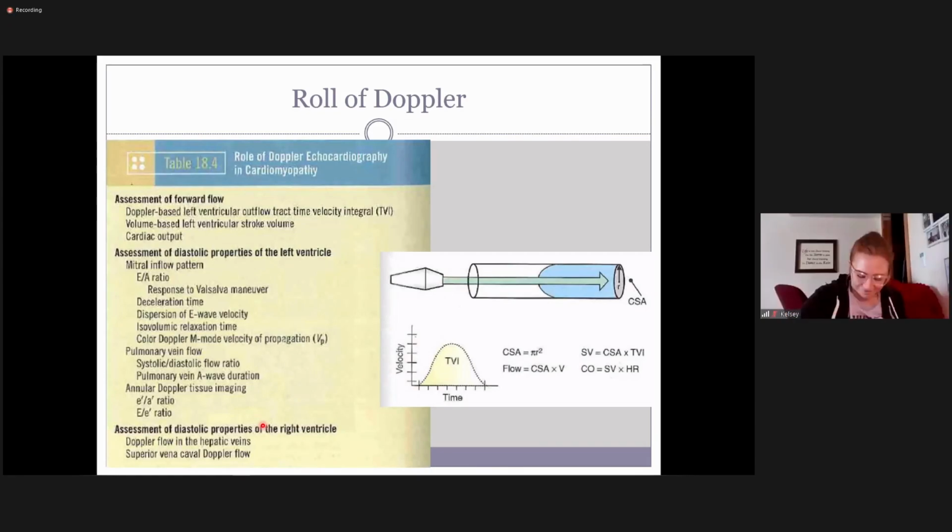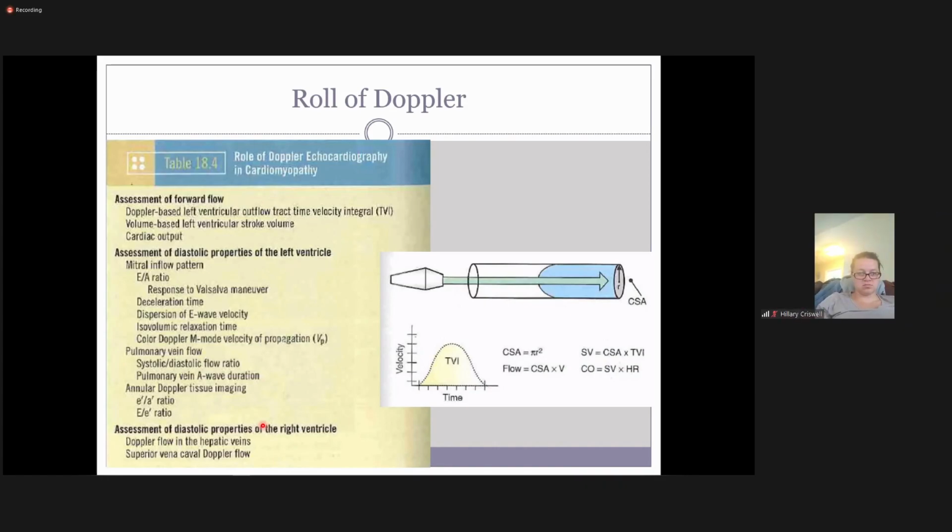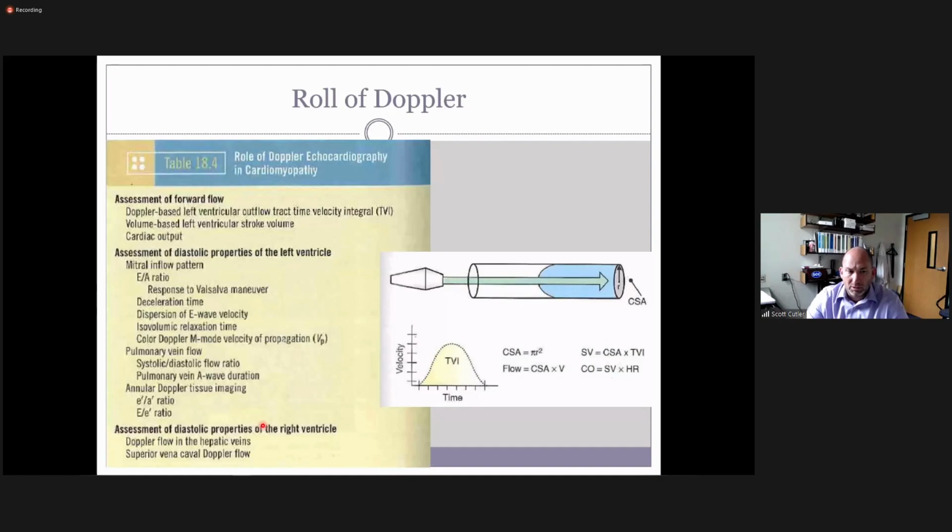No. Which way do we see it usually? Low baseline. Down, yeah, below baseline. But don't be thrown by it. It all really depends on where you're coming from.